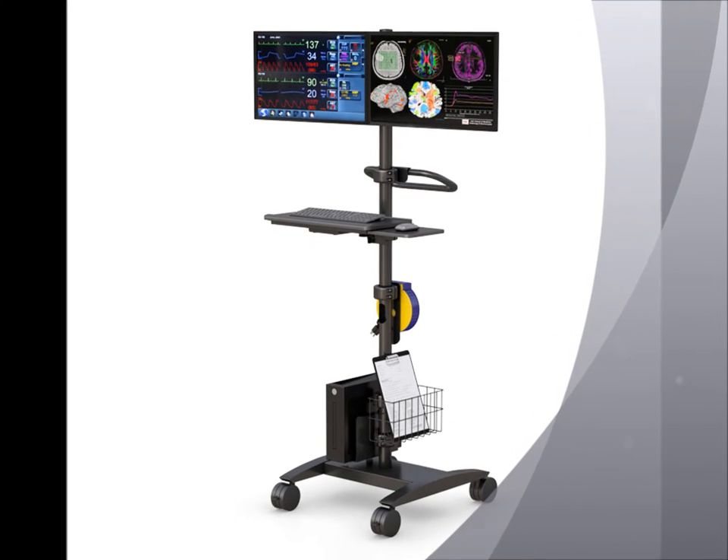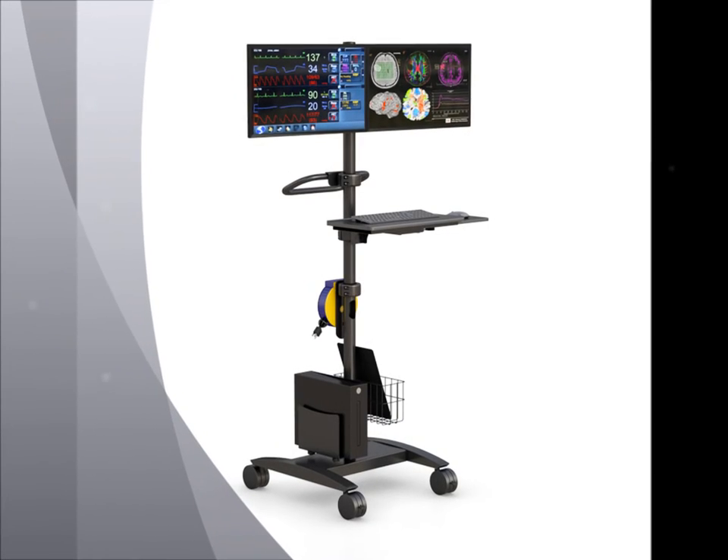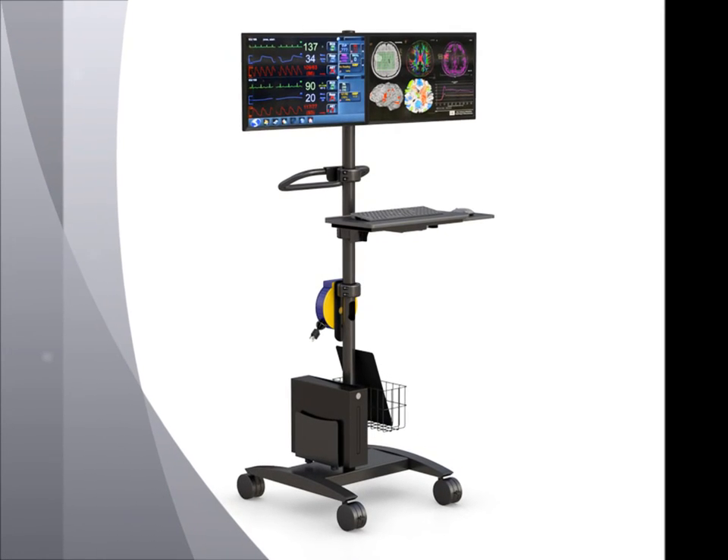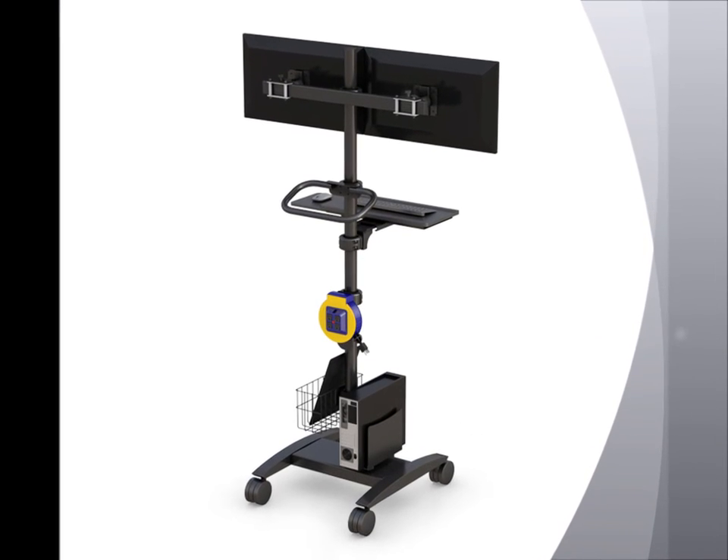This premium high quality dual monitor mobile medical pull cart is designed to provide convenience for the user. It allows the user to read all the data on a wider monitor. This workstation provides enough working space in any required location.